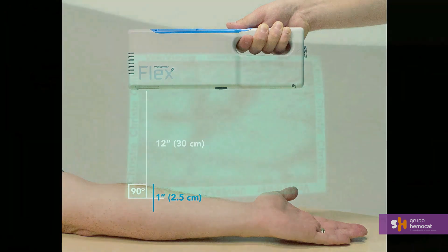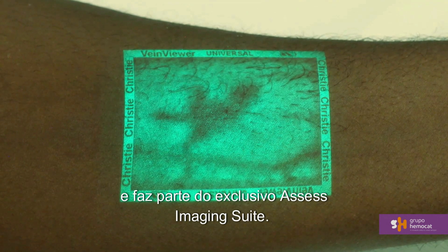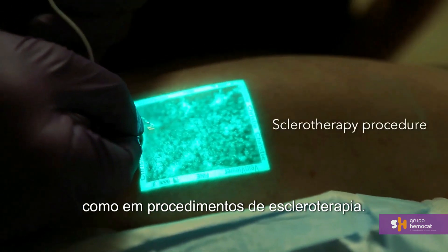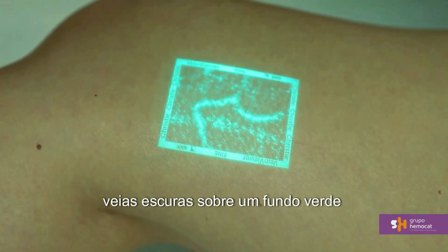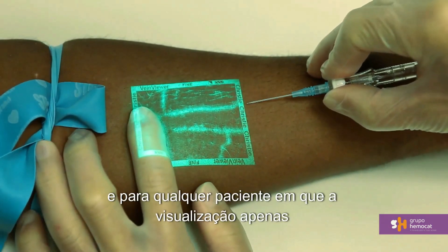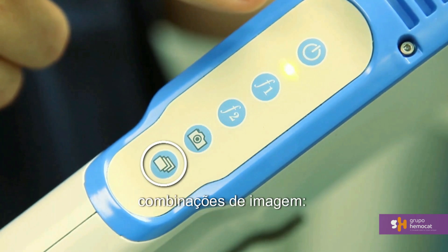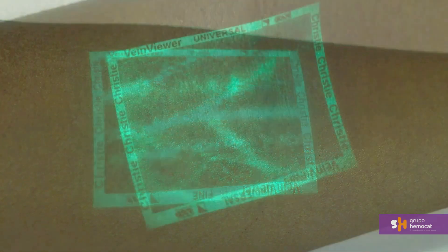VeinViewer Flex comes standard with Universal Imaging Mode, which is appropriate for all patients and part of the exclusive Assess Imaging Suite. Fine Detail further enhances vascular structures to highlight small vessels — useful for pediatric and neonatal patients and sclerotherapy procedures. The Inverse mode reverses the color of the veins and surrounding tissue, switching from dark veins on a green background to green veins on a dark background; this mode is very effective for darker skin tones. Activate Fine Detail and then Inverse by pressing the mode button sequentially. VeinViewer Flex cycles through: Universal Standard, Fine Detail Standard, Fine Detail Inverse, and Universal Inverse.